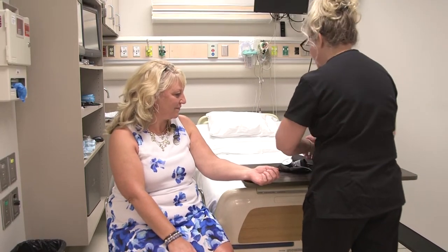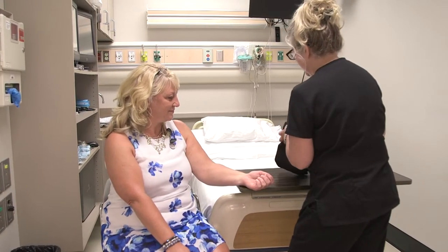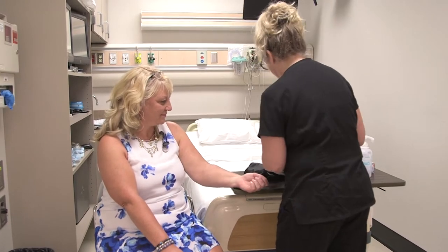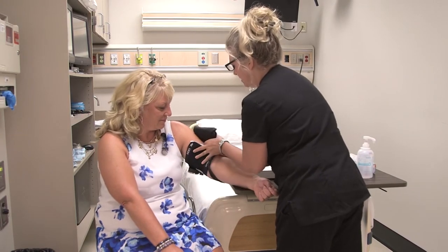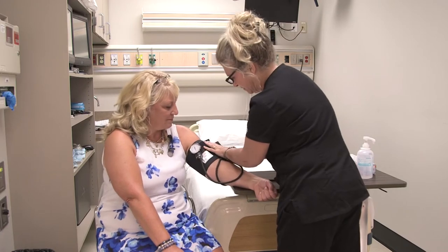So we're going to check your blood pressure. Have you ever had that performed before? Great. So what we're going to do first is I'm just going to put this cuff on your arm — it's going to go on your upper arm. The proper way to put a cuff on is to make sure that the bladder covers two-thirds of the upper arm circumference.